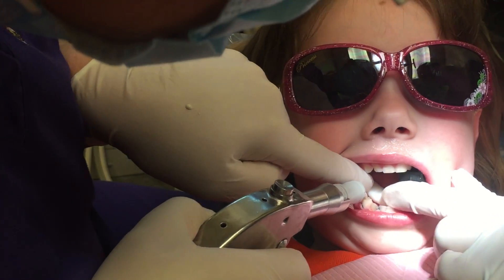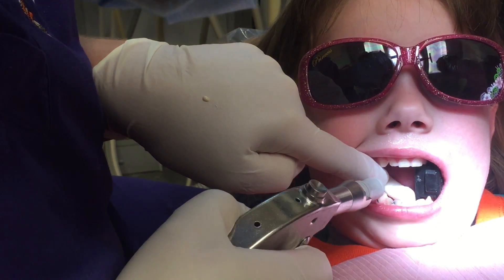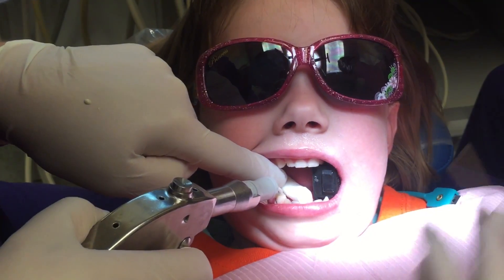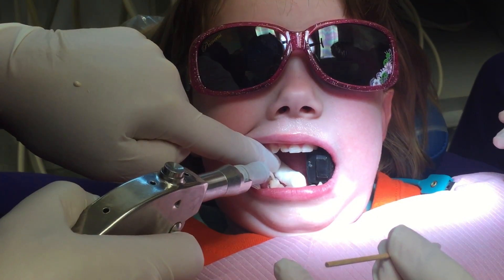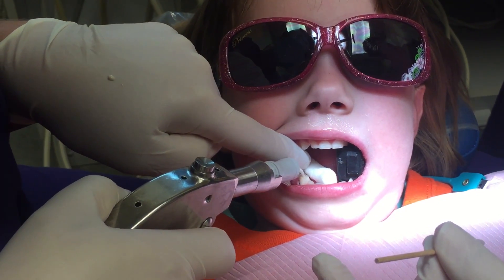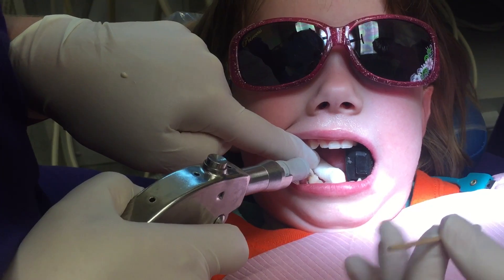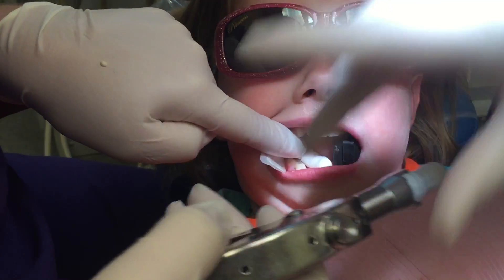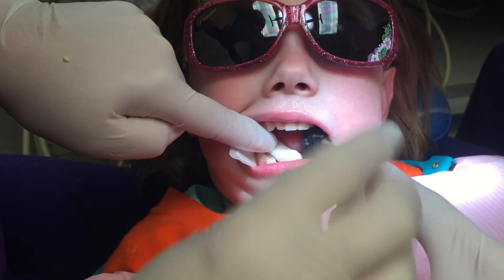I got it really good actually. Can you just pass me a wet q-tip? You'll still see that gray coming from between her teeth, but that little tiny hole on the chewing surface will be covered. Just stay away from lollipops, Starbursts — things that might pull it out of there.